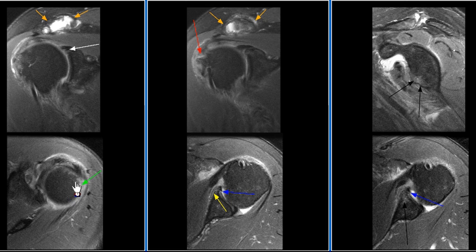Also noticed is localized edema in the posterolateral humeral head in the location of a Hill-Sachs lesion. There is mild edema in the anteroinferior glenoid rim.